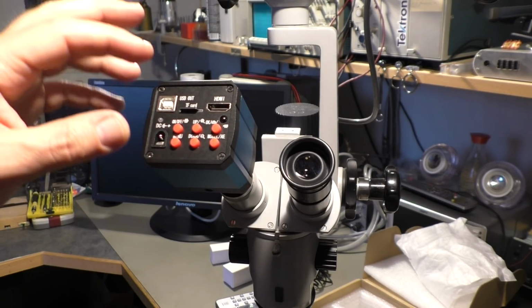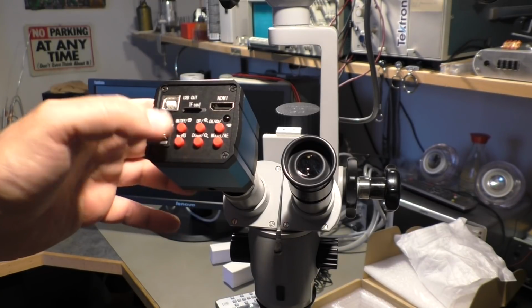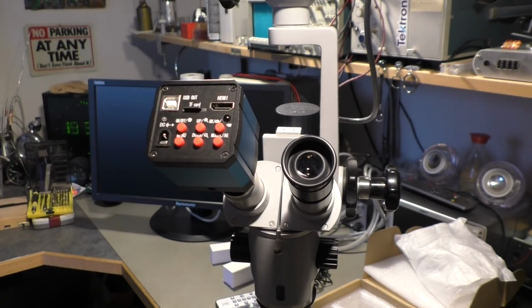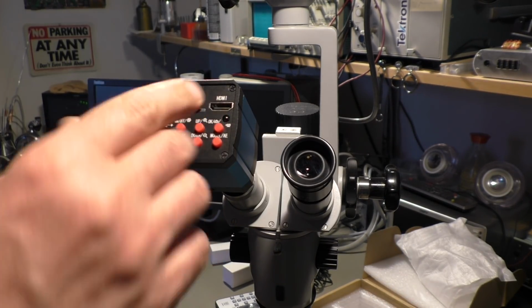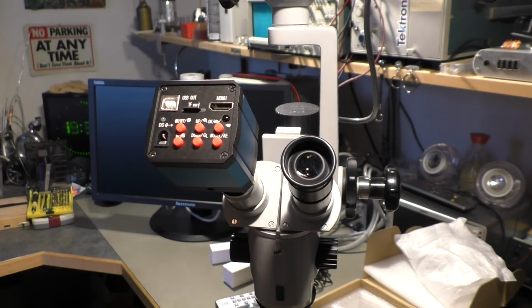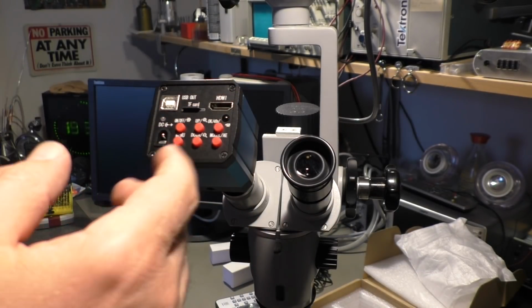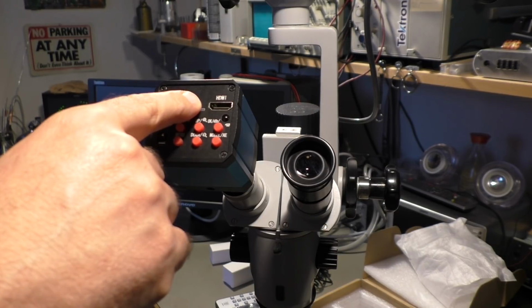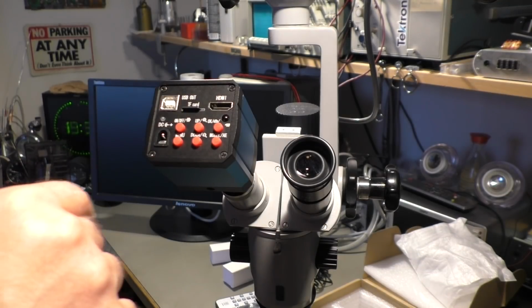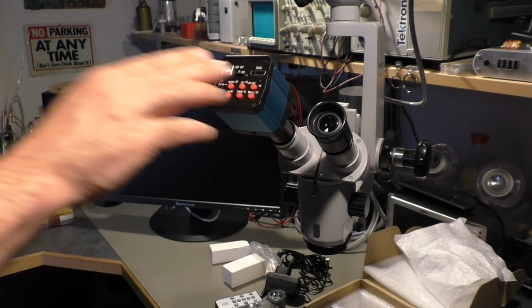And the other downside of the USB output is you don't see the menu here. You only see that when you connect the HDMI output, or maybe I'm doing something wrong, I don't know, but I recommend to have at least a small screen. I already ordered one, a 7 or 10 inch screen for the HDMI as a control monitor. And then of course you can record movie and still images to the micro SD card here. And yeah, that's how it works. Let's connect it to the screen.